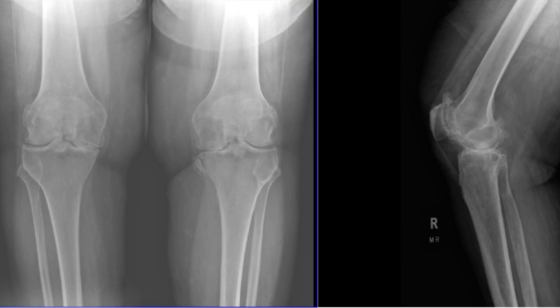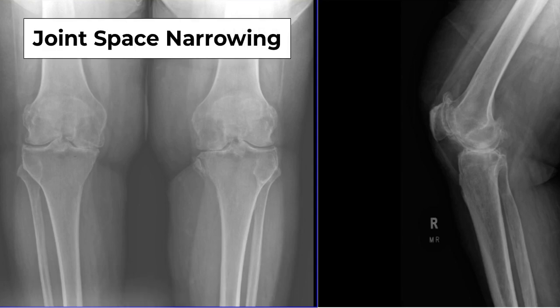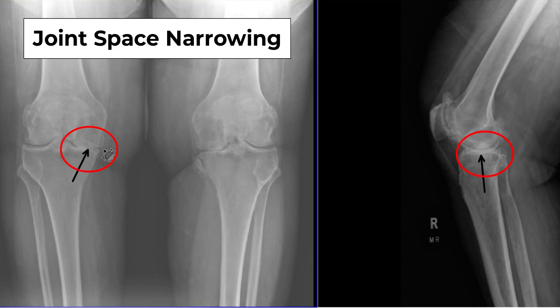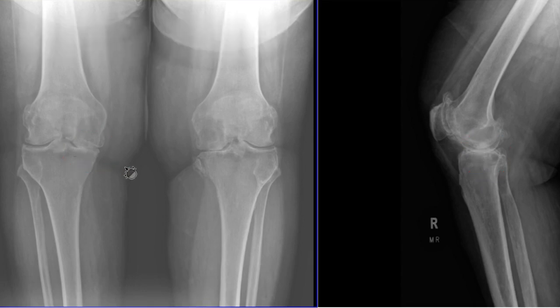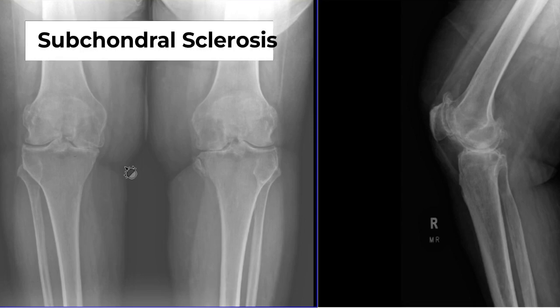We look at x-rays to determine if you may be a candidate for a knee replacement. The first thing we look for is joint space narrowing. On this x-ray you can see that there is no more joint space and that these bones are directly in contact with each other. This is what we call bone-on-bone osteoarthritis.